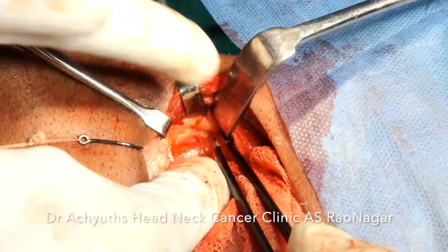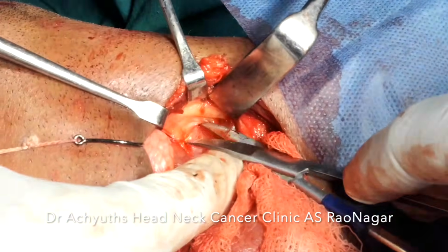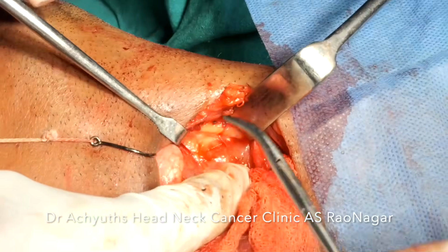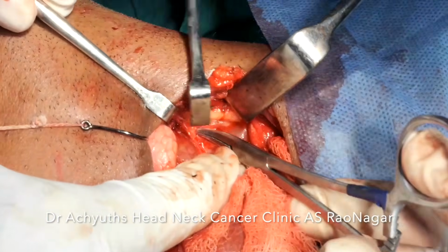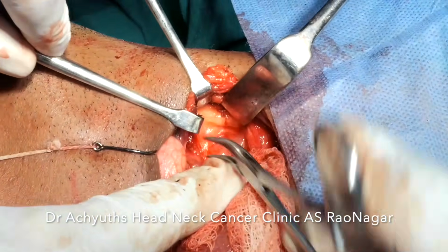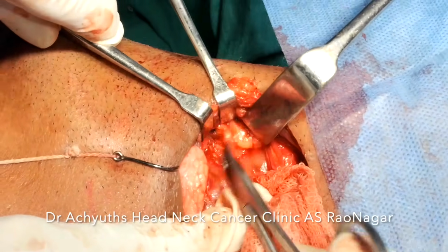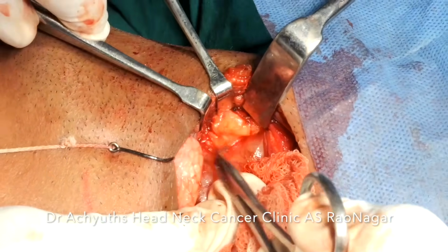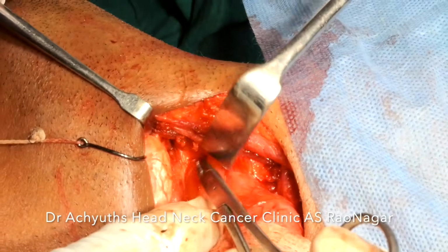So technically it is not endolarynx, but then we are working inside the larynx. So in this way, without dividing any thyroid cartilage structures, we are able to get away dissecting the medial surface of the internal component of the laryngocele.